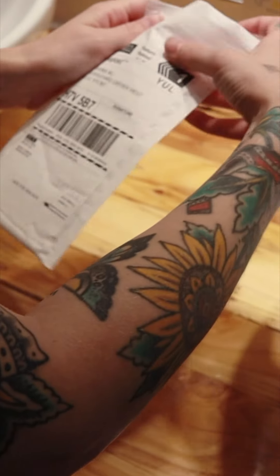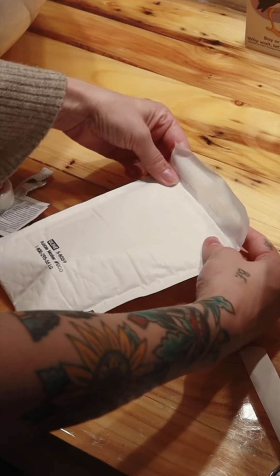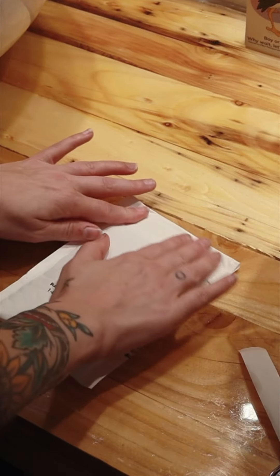Then, place the well-sealed tube in the plastic bag with the absorbent fabric and seal the bag. Finally, insert the sealed bag inside the shipping envelope and take it to the post office.